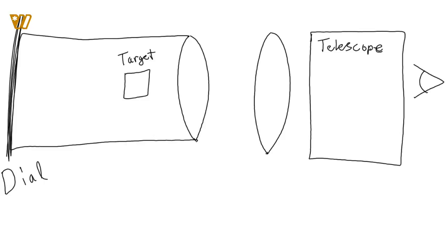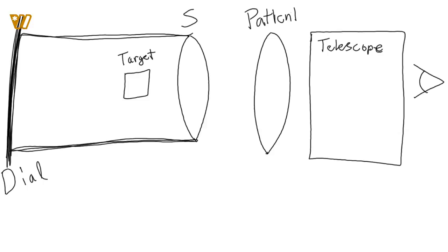Whenever you look in here, you'll see I drew in a tube, because whenever you think about doing lensometry, like the old manual lensometers, there's this big long tube. You have the dial here at the back that you spin to locate the axis of your line, to make those line images clear. So you have a standard lens right here, and then here's going to be your patient's lens, or the test lens.